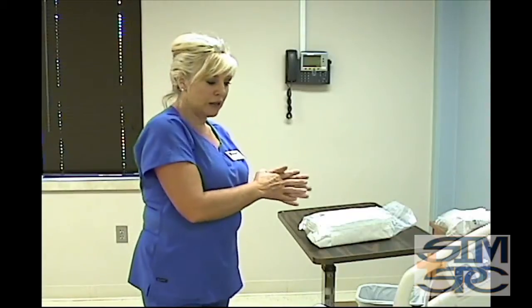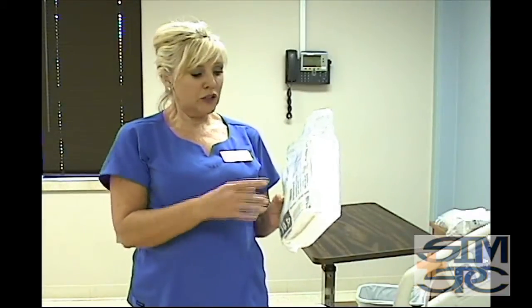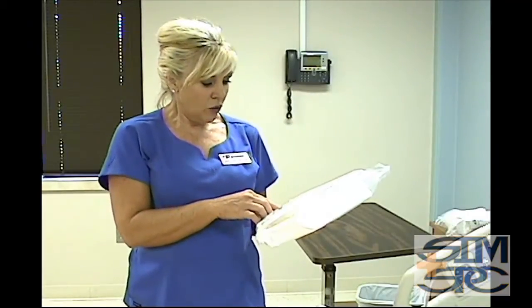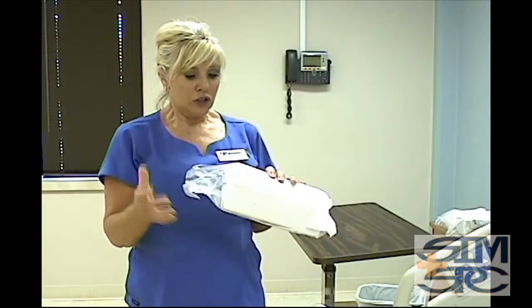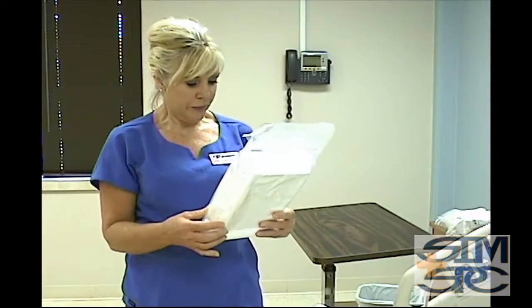Once you've washed your hands, you're going to go to the supply room and get your supply. And as far as this supply, you're going to look to see what size it is. And if the doctor specified a size, then you would want to make sure you got the size. This is a 14 French. And also on here, you're going to look for the expiration date, and it's right here. When you do get your kit, you also want to make sure that it's completely sealed and that there's no openings or it hasn't been opened. Once you have that, then you can go to your patient's room.